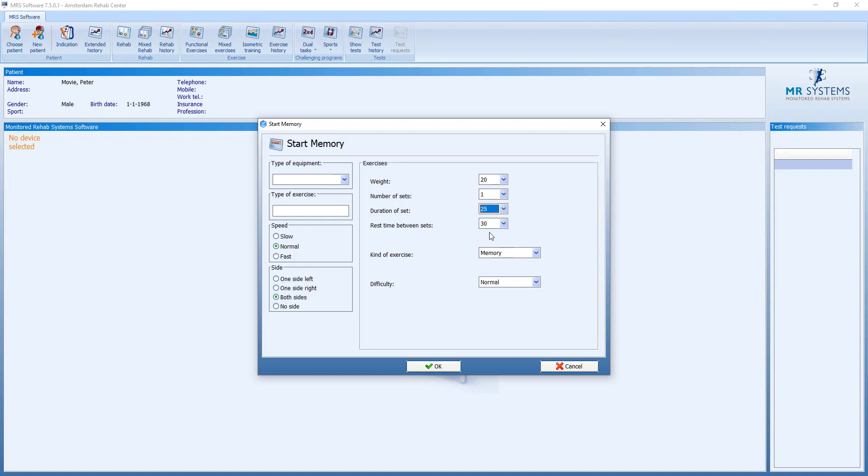We do 25 seconds. The memory is the exercise. The level of difficulty is normal.